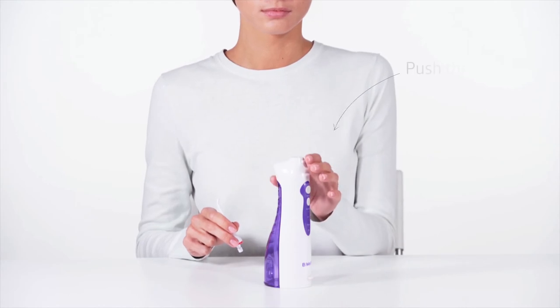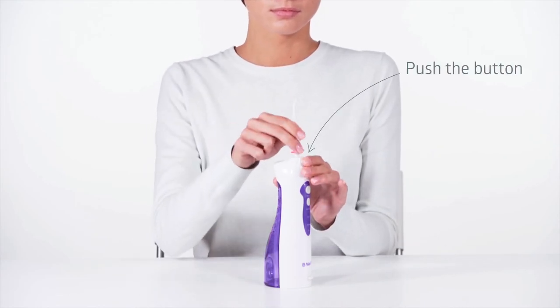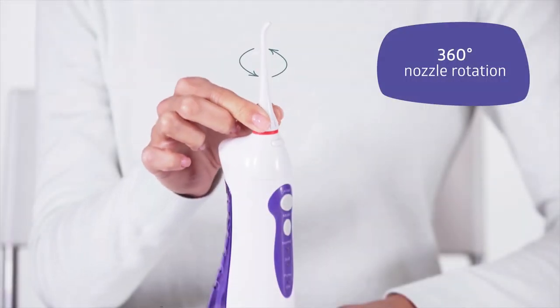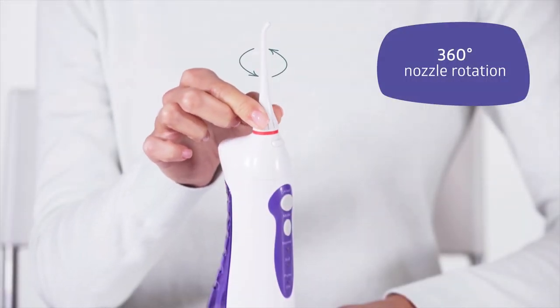Position the nozzle. To position or remove the nozzle, push the button. The nozzle rotates 360 degrees, ensuring comfort and efficiency.